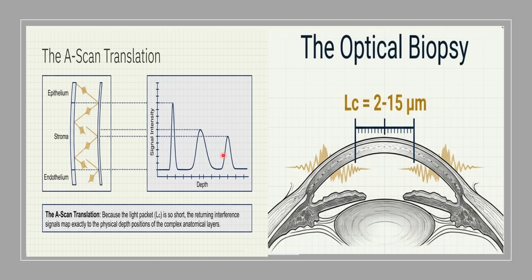Now the B scan that we are seeing in the image is two-dimensional, and is made up of thousands of these A scans. We will speak about them later. These thousands of A scans will form the two-dimensional, very fine, beautiful, histological-like structure of the cornea or the retina, which we see by B scan. That's the B scan, which is made up of plenty of A scans. So these are the basic principles of the OCT. I need you to memorize this.